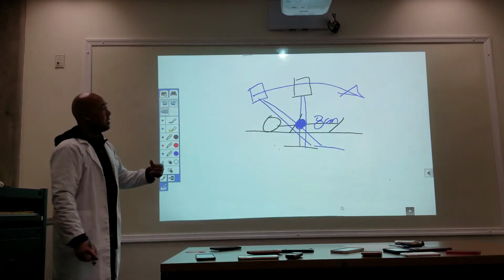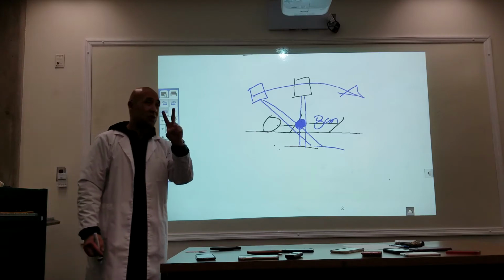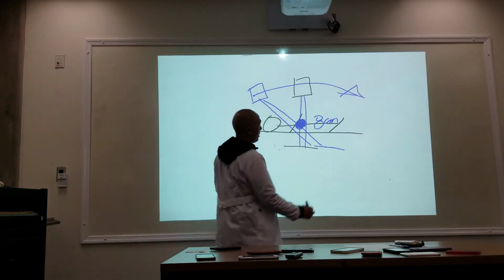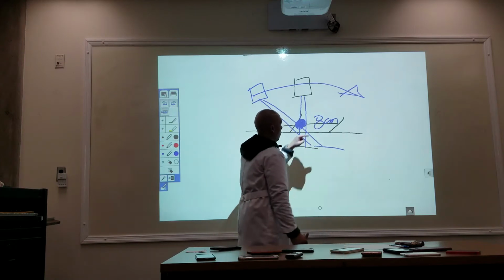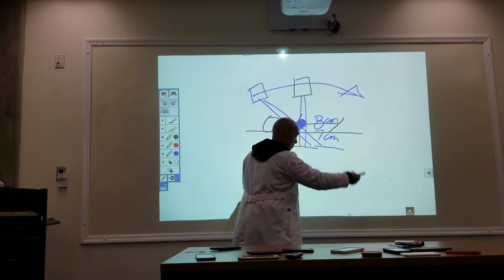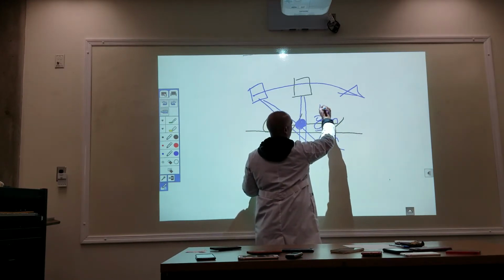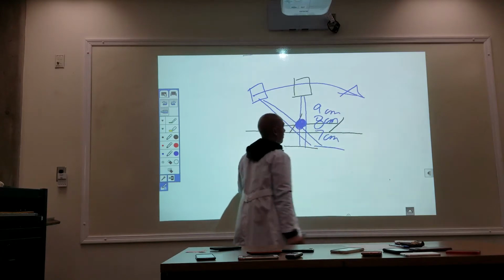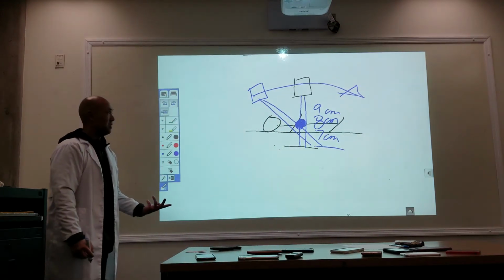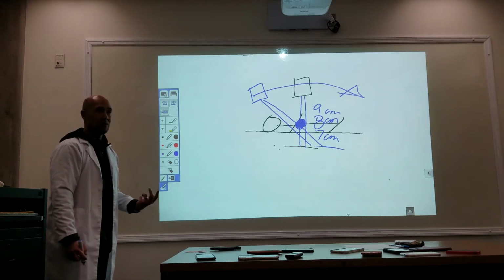If you are doing nephrotomograms, there are usually 2 other shots that you have to take, 2 more nephrotomograms. You're going to do one at 1 centimeter below. So you're going to adjust it to 7, and then you're going to take another one at 1 centimeter above. And that's why you've got to be quick in doing this, because we're looking at the initial filling of the renal parenchyma.